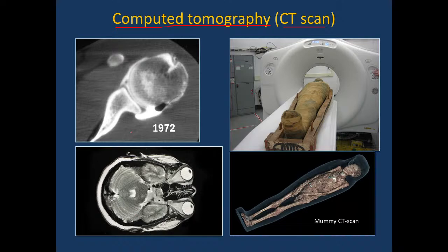All doctors use CT tomography to study lungs in the pandemic areas. The first computed tomography scan was created in the United States in 1972. This figure shows the first image in California. It is the first image of the shoulder joint here. It is not very good, but it was possible even in 1972.